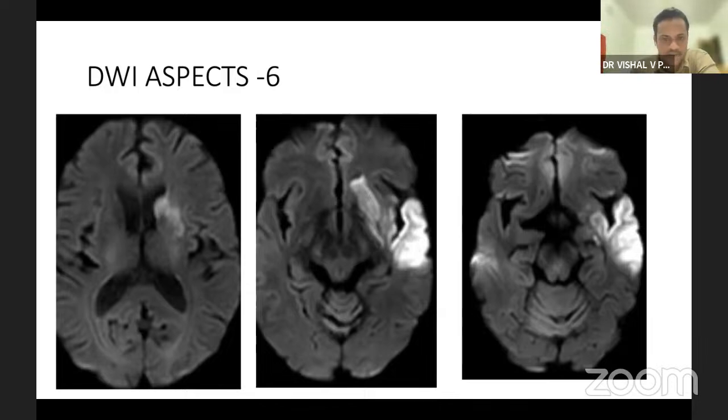Okay. Yes. 6 hours. Imagine if you had a cardioembolic stroke, you would have seen these T occlusions, cardioembolic. How many would you have seen? They will all be present in a very bad state. Bad state. Correct? You don't have the time. You know, they might come even in 2 hours. You won't have the time. But look at this MRI. This is very surprising to me.